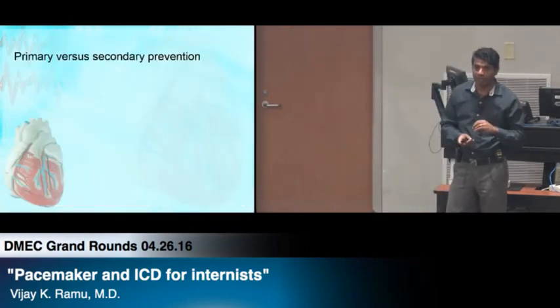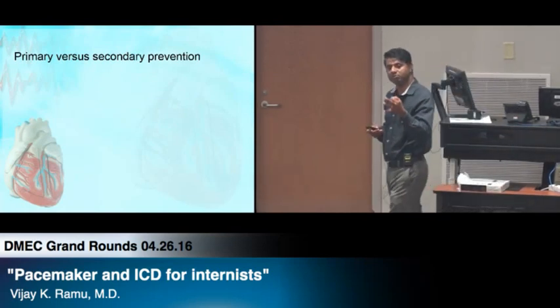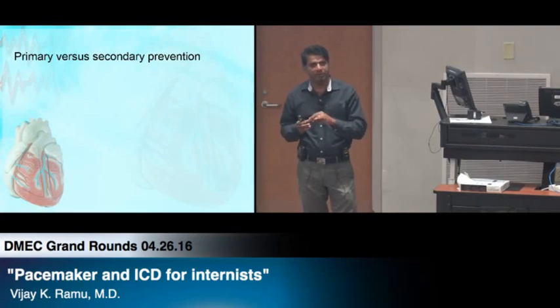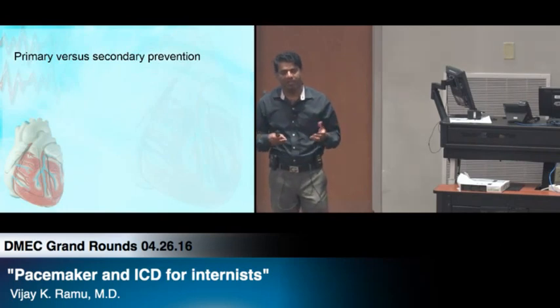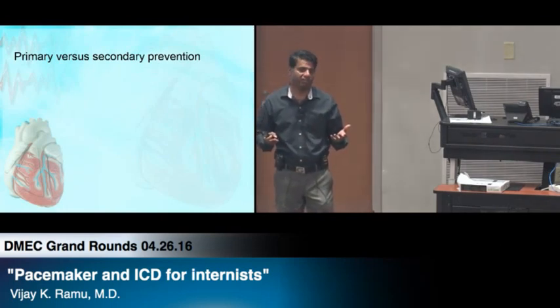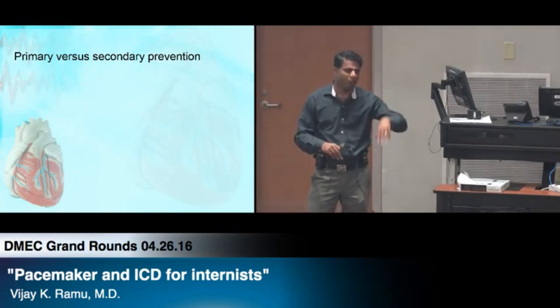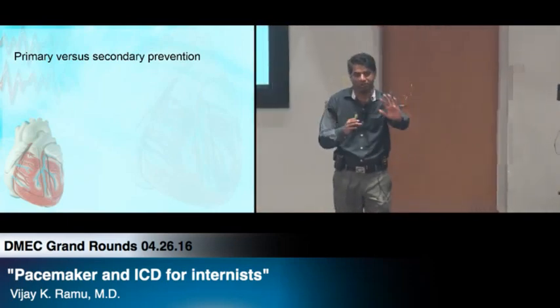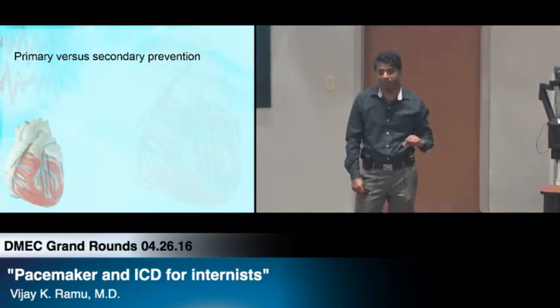Now, the other concept of ICD: primary versus secondary prevention. This is a part internal medicine residents should know. Just to make it easy for you to understand, in the early 90s, if you admitted a patient with a defibrillator, it was a big deal. I used to tell people, I've got a patient with a defibrillator, and everybody asks, what happened? Oh, he had a cardiac arrest, and somebody put in an ICD. Wow, everybody in the group sees the patient, we're all happy that we saw a patient with an ICD. Pacemakers, we saw all the time. ICDs, we never saw that many. Why?